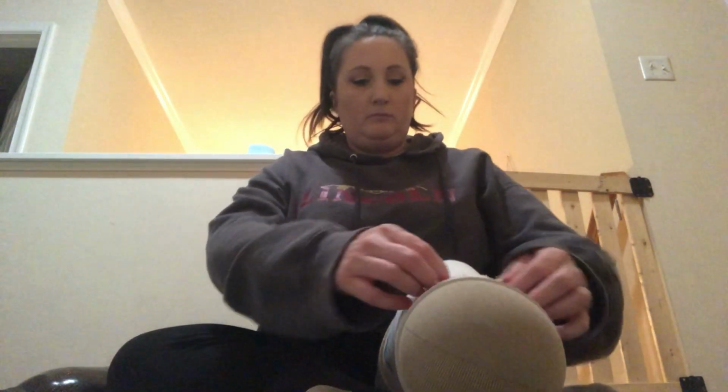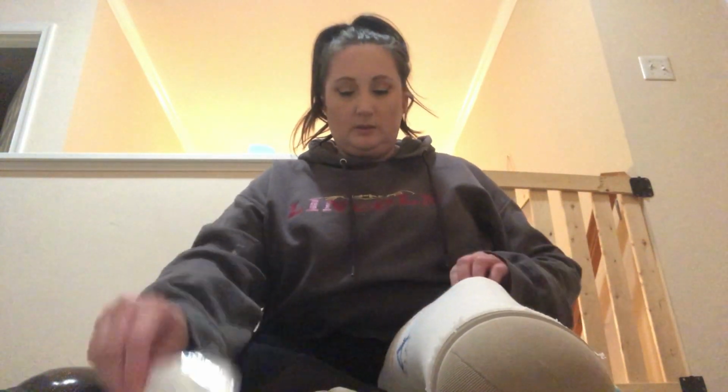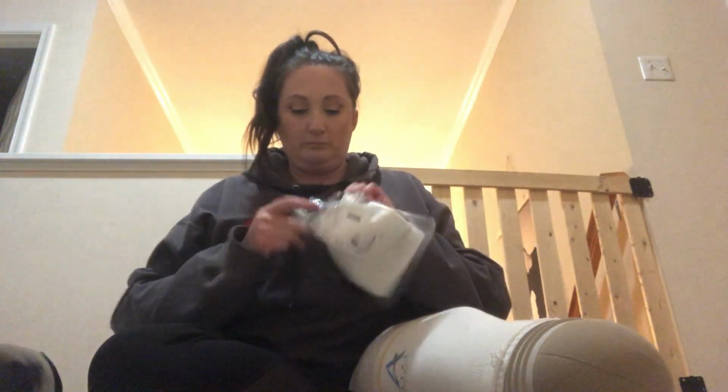All right. So that is 6-ply on the sides. I'll probably need another one, but I'm going to try it first. Okay, success. No sound, still, but I'm still end bearing and it hurts really, really bad. So we're getting somewhere. I'll add another sock. See if I can girth up my sides a little bit more. So this will be a total of 9 ply.